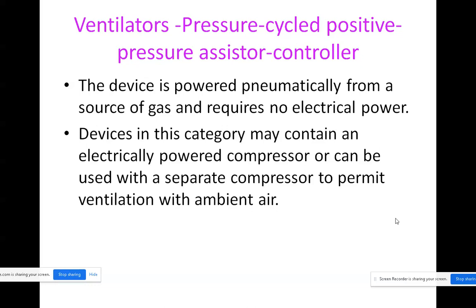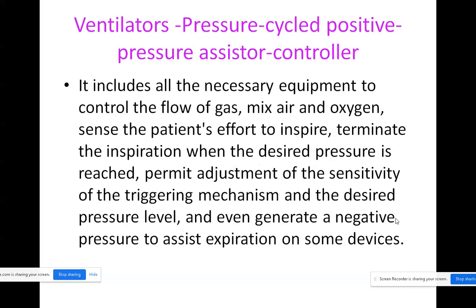That means the compressor alone will be working under electrical power control. The compressor is nothing but what provides the ventilation to the lungs.